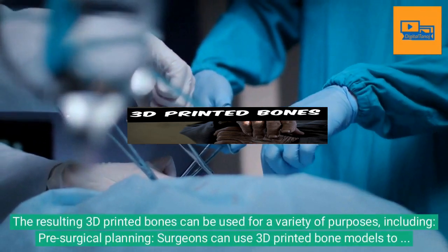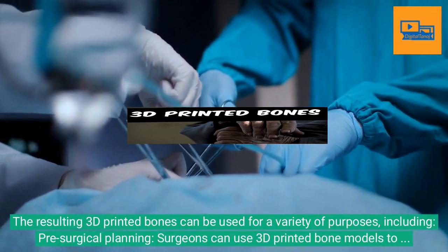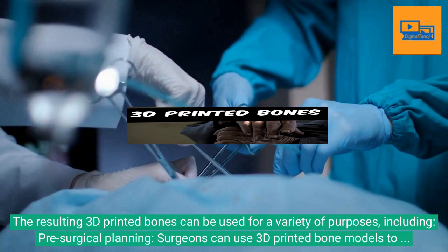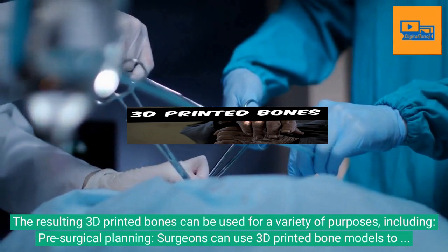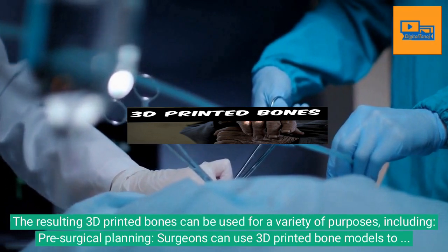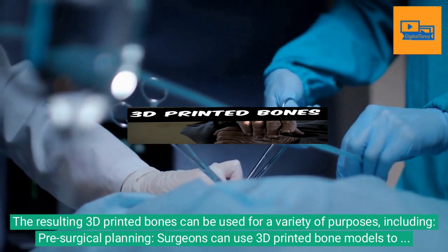The resulting 3D printed bones can be used for a variety of purposes, including pre-surgical planning. Surgeons can use 3D printed bone models to study and simulate surgical procedures, allowing for better surgical precision and reducing the risk of complications.